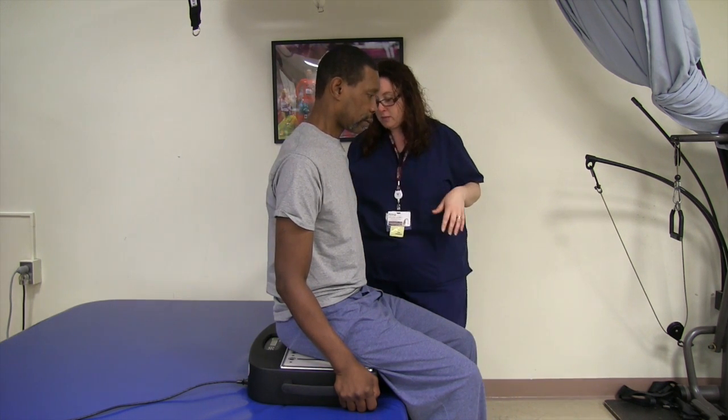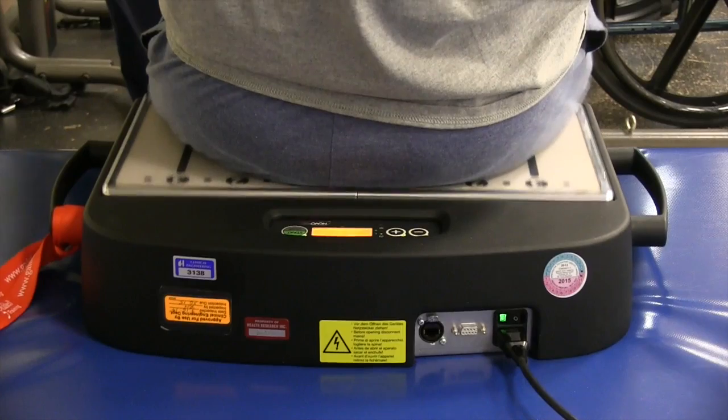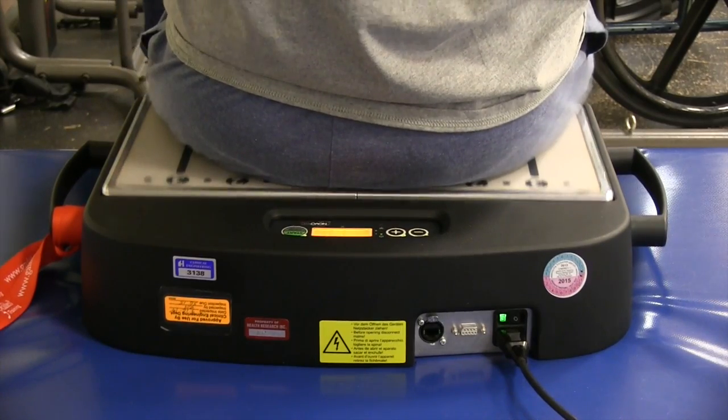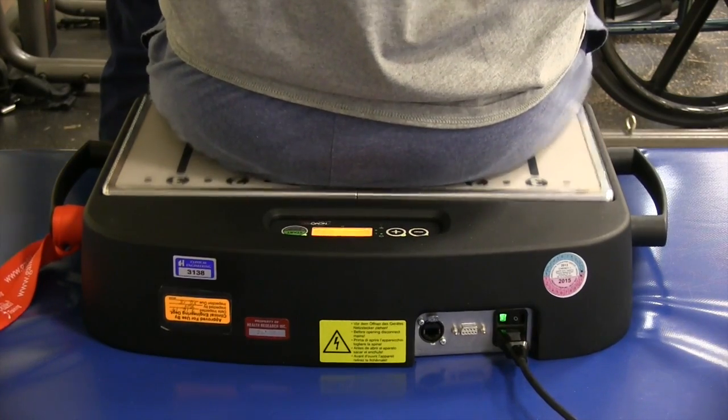Your abdominals, your back muscles, your pelvic muscles — things like that. Okay, let's do some shoulder blade exercises. You're going to pinch back — good, much better — and relax. Good, again, pinch back.